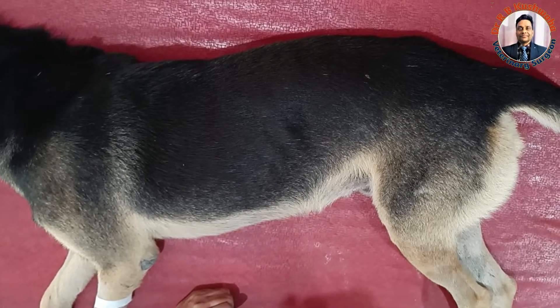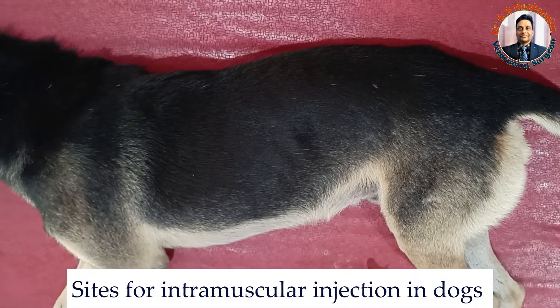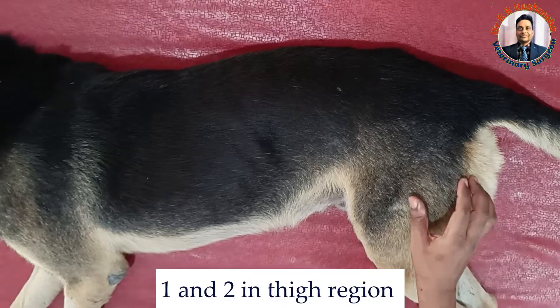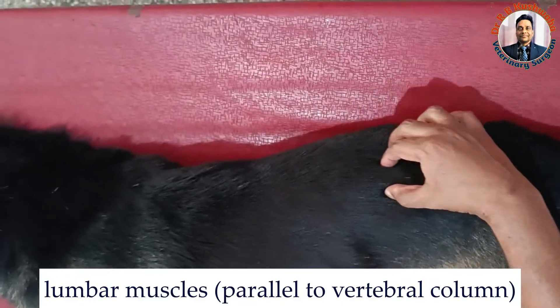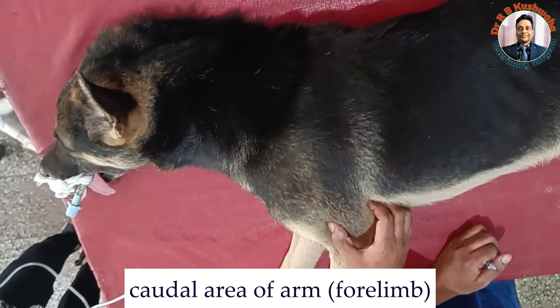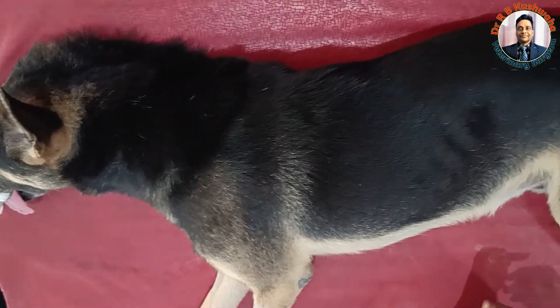Today I am going to tell you about the different sites for intramuscular injection in the dog. There are four sites for the intramuscular injection. The most important one is the caudal thigh area, then the lumbar area, and the caudal area of the forelimb. Now we will demonstrate one by one.